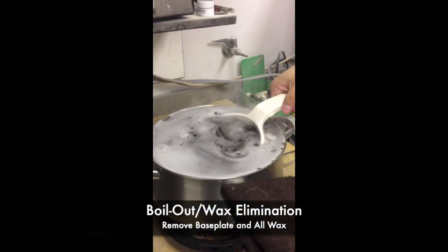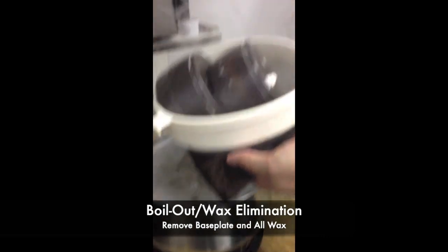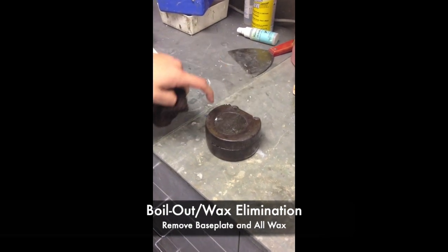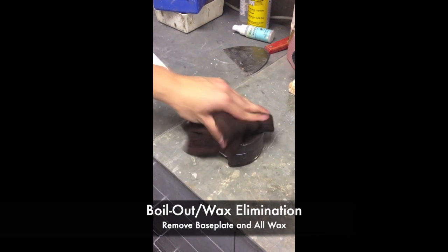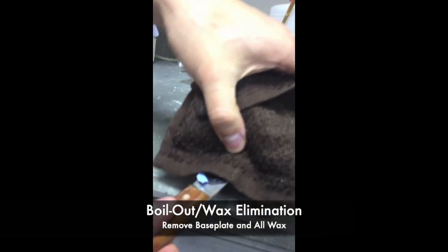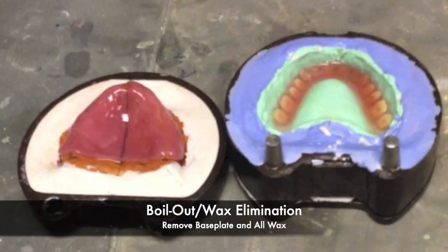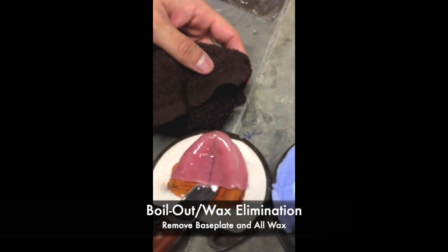The first procedure is boil out and wax elimination. You will soak your flask in hot water with a boil out solution inside for about five to seven minutes. When ready, remove the flasks. With the knockout plate facing up, open the two halves of your flask. Inside you will find melted wax and your base plate. You can remove your base plate and throw it in the trash — you no longer need it.